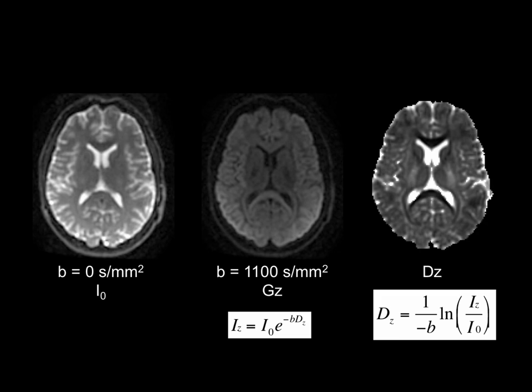But you can see basically that what I'd like to point out here is that not all of the white matter has the same intensity in the image or has the same diffusion coefficient when we're just applying in this z direction. And here we can calculate just in the same way as we did for the ball of water.